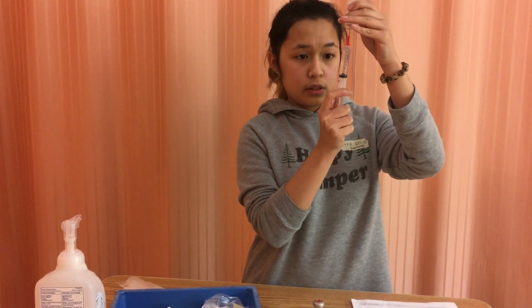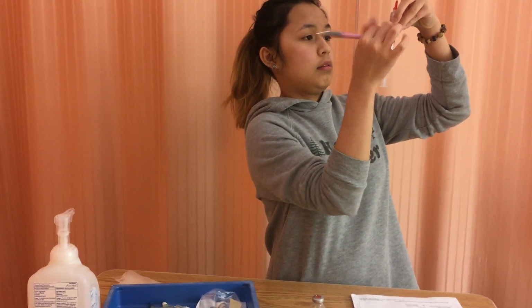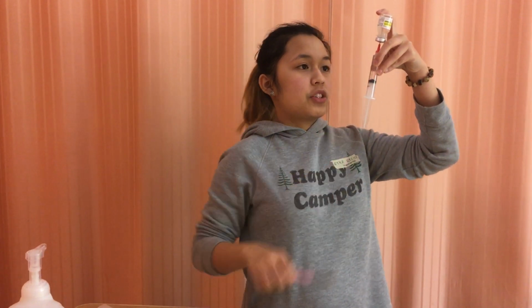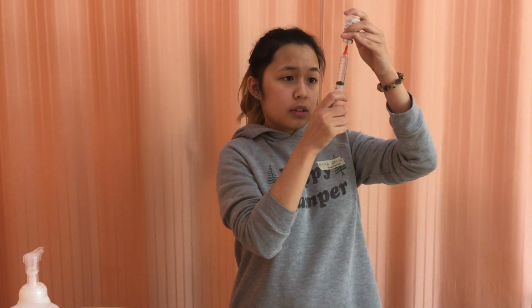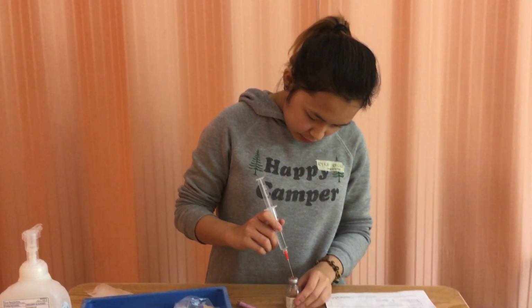And I'm going to tap to get rid of the air bubbles. Make sure it's 8.2. So now I'm going to add this to my medication.